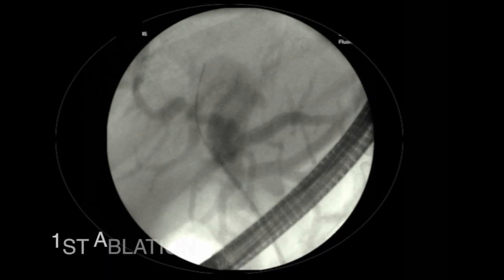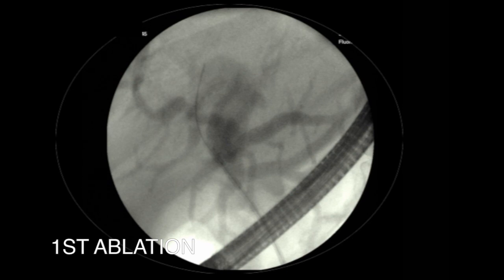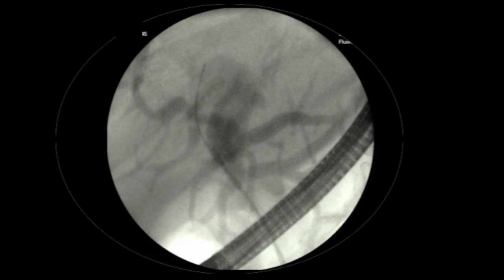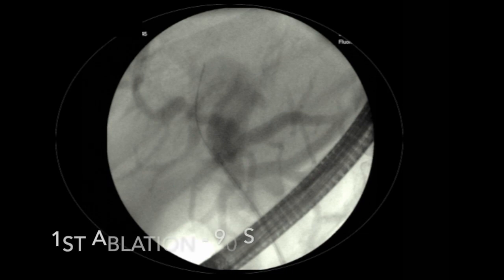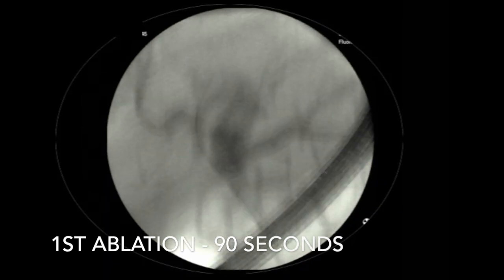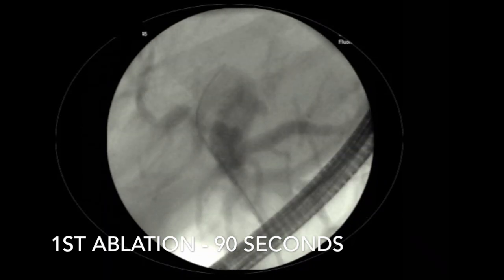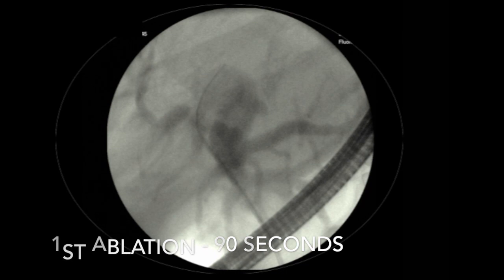We perform our first ablation. Because this is in the intrahepatic portion of the system, we ablate at 7 watts for 90 seconds. After this ablation is completed, there is a one-minute cooldown where the catheter decreases its temperature. We then reposition the catheter down to the distal extent of the tumor, which was noted to correlate to the top of the ERCP scope.